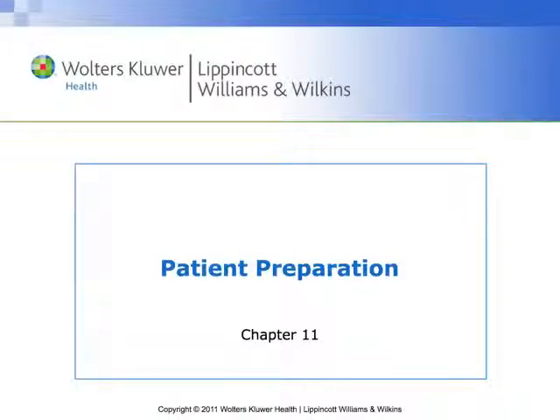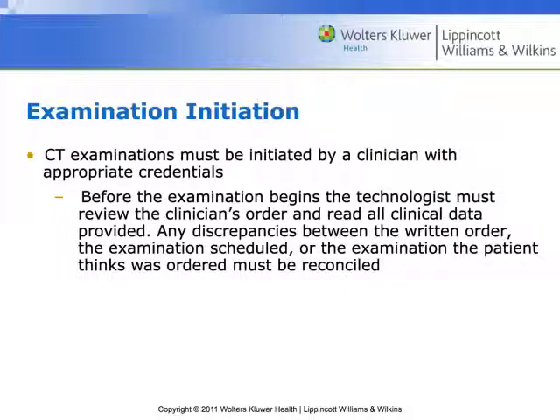Okay, patient preparation. Before I even go out and get a patient, the first thing I want to do is make sure that an actual physician ordered an actual CT scan on this person, right? It seems like a no-brainer, but I've been at some facilities where we were so busy that one of the senior techs was given time just to do this, because some people will order some real wackadoodle stuff, and it's like, hold the phone. We do not need to be doing double contrast CT of the abdomen pelvis on a 16-year-old girl. She clearly needs an ultrasound, right?